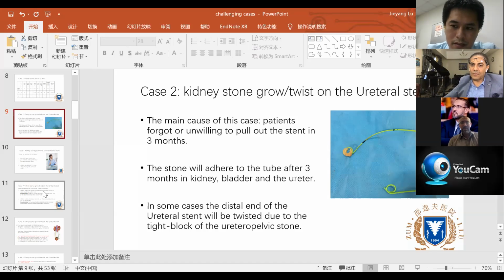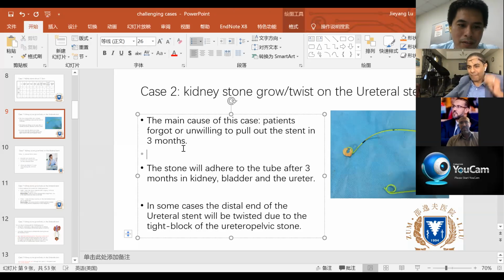It's most welcome. Yes. Okay, I think in our hospital, the best treatment in these cases is what I introduced here, using the flexible scope, because PCNL does too much damage to the patient and ESWL is not quite sure to pull it out. And once you have kidney stones and stones in the bladder, only PCNL or only ESWL cannot hit the stones in the bladder.